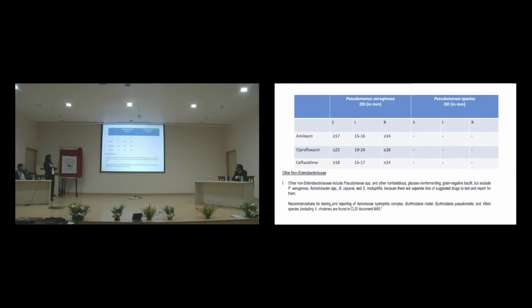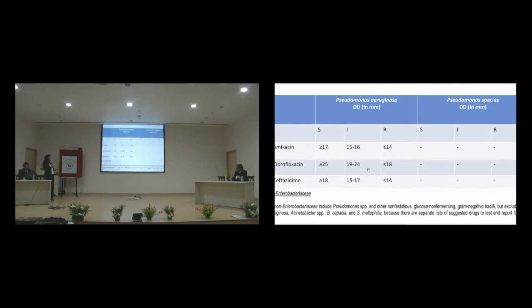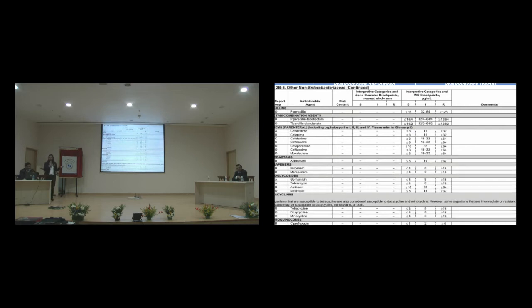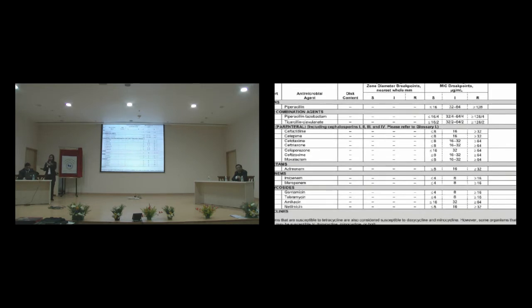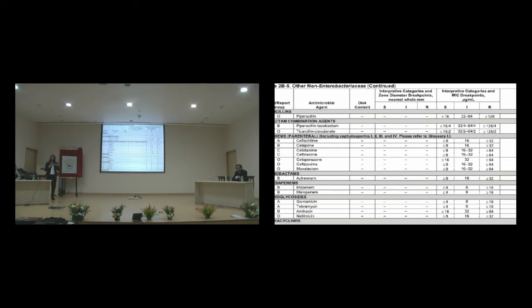You can see in CLSI, this group is given as non-Enterobacteriaceae, that is, other than Pseudomonas aeruginosa, Acinetobacter, Burkholderia cepacia, Stenotrophomonas maltophilia. The rest all come under this non-Enterobacteriaceae family, and most of them do not have disk diffusion breakpoints. Only MIC breakpoints are available. In such cases, it is better to report the identification as one of the Pseudomonas species or whatever you have identified, and AST report cannot be performed. If you don't have an MIC facility, AST report cannot be performed because clinical breakpoints are not available. Because it is being done in a methodical way, we can't just extrapolate randomly. You cannot choose to report putida with the help of the aeruginosa group. The data will become wrong. So it is important to give that note if the disk diffusion breakpoints are not available.